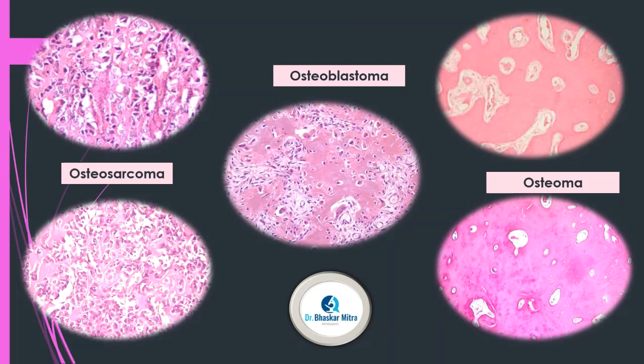It may be benign. Here the benignity of the lesions is indicated first by the cellularity, the cellular atypia, presence of mitosis and other bony destruction, lymphovascular invasion or the aggressiveness of the tumor. In between this benign and malignant, there is an important entity in cases of orthopedic or bone pathology, the aggressive benign lesions. The aggressive lesions are actually benign lesions, but they behave more aggressively, they spread, they recur. So these are the aggressive lesions.